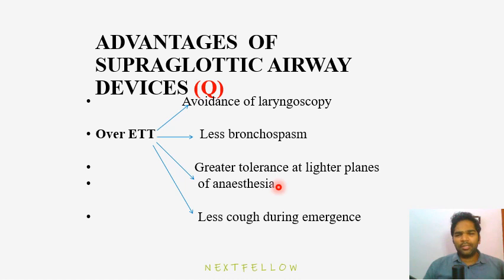See, in daycare surgeries, in small duration surgeries, you don't need to sedate or paralyze the patient too much, because they need to go home at the end of the day. So lighter planes of anesthesia itself are enough. The patient will tolerate the LMA very well compared to an endotracheal tube.